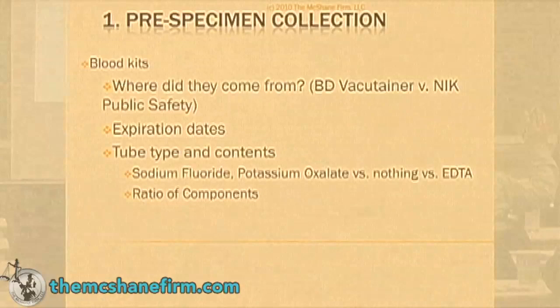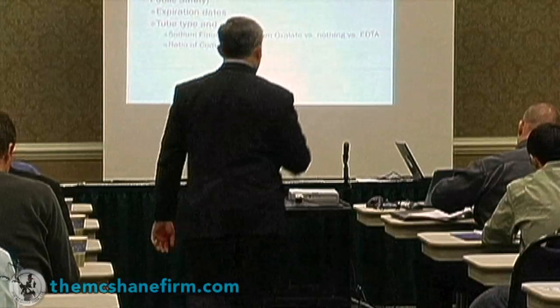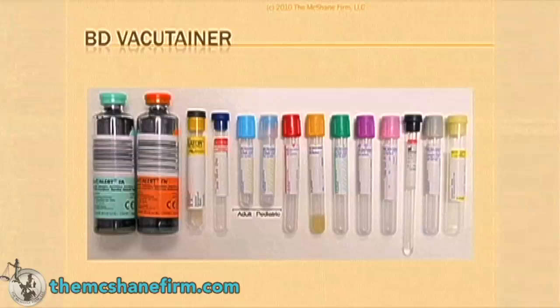So what I'm going to do is pass it around. Feel free to open it up. Take a look at it. Here's some tubes. What you have to understand is that all tubes are not made the same. Even if there's the same color tube top, it does not have the same components necessarily. This is the gray tube top, the one that we are mostly going to be dealing with.